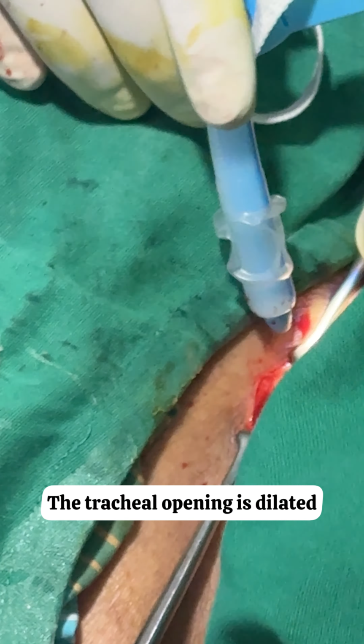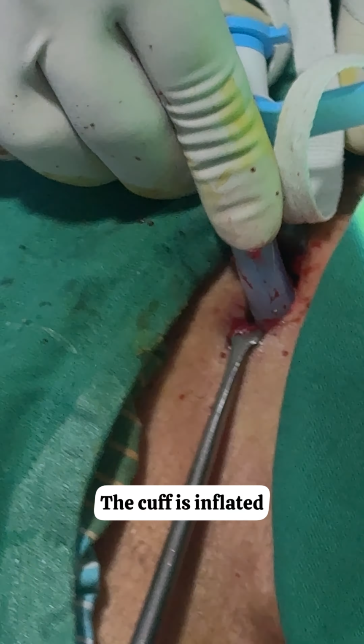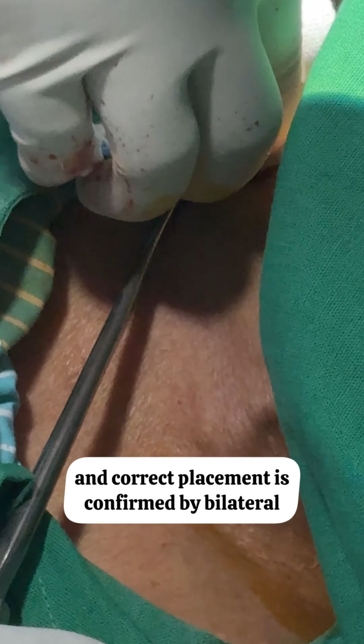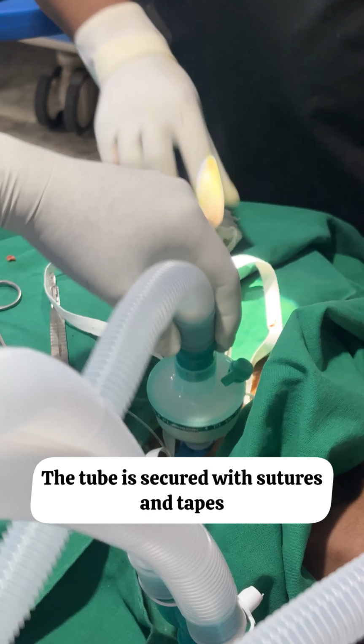The tracheal opening is dilated and an appropriately sized cuffed tracheostomy tube is inserted. The cuff is inflated and correct placement is confirmed by bilateral chest expansion, oxygen saturation improvement, and capnography. The tube is secured with sutures and tapes.